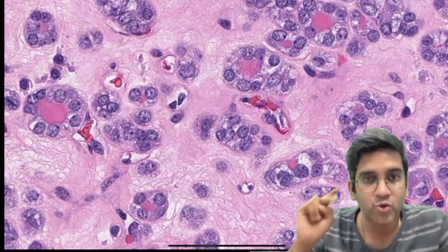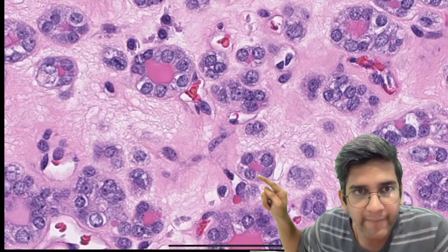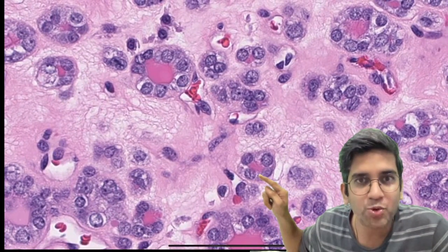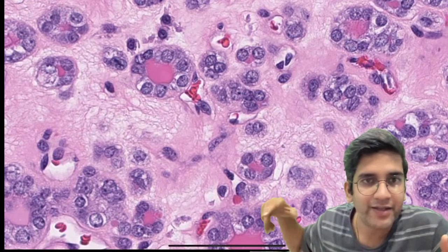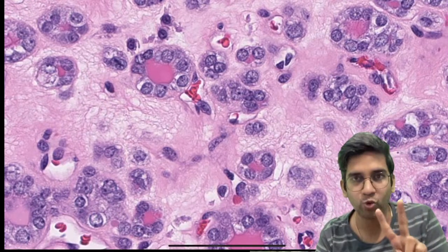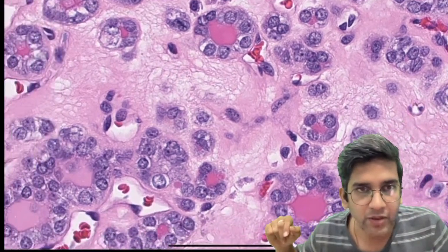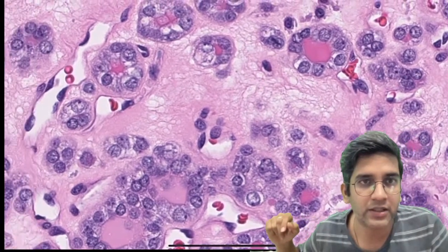Perfect. So I have 2 of 3. Actually, can you see a groove here as well? You can. The beauty of grooving is you start seeing one, and it looks like many other cells are having grooving. Actually, this is enough for me. I have 2 of the 3 features of the PTC, right? Perfect.